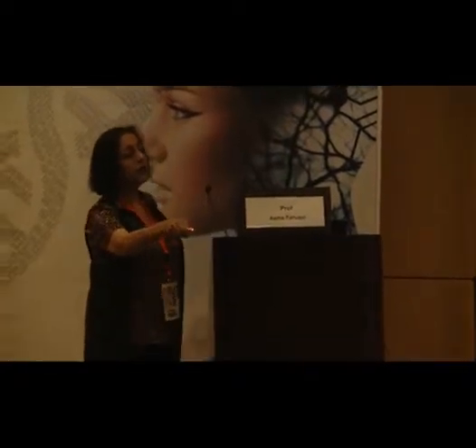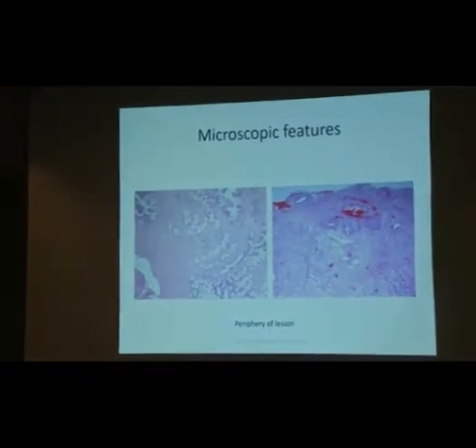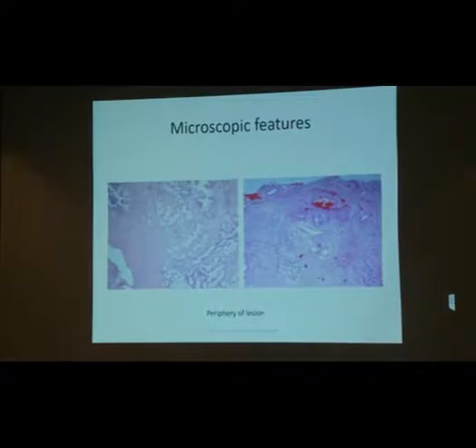This is what it looked like. So you can see lobules of mucinous glands and some duct-type structures here and there. In size, it was about 6 to 7 centimeters in diameter. This is a higher power view of it. You can see mucinous glands and you can see these variable sized cysts. This is just another view of it. You can see these mucinous jobbies over here.